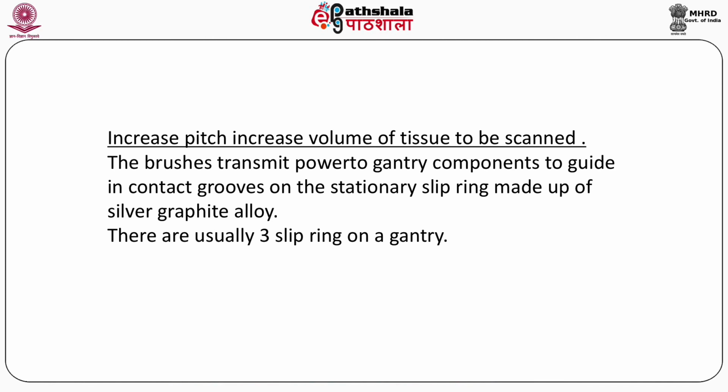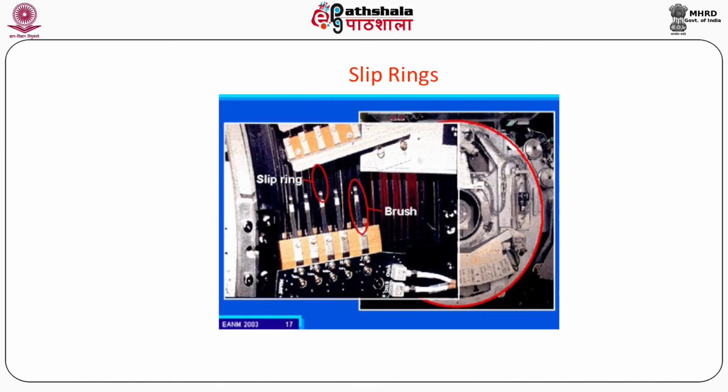The brushes transmit power to the gantry components, guided in contact grooves on the stationary slip ring made of silver graphite alloy. There are usually 3 slip rings on the gantry, you can see here.